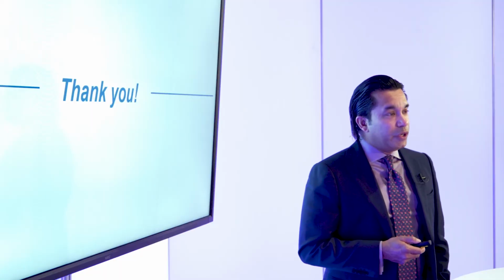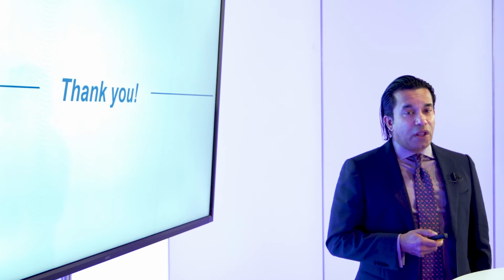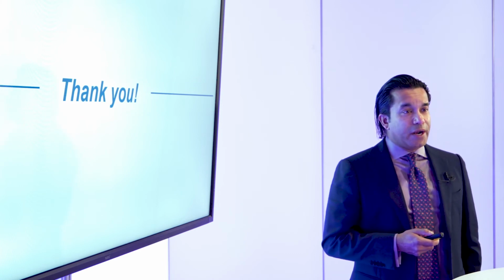So the question is, what tips and tricks are good for treating nodular calcium? I think it's a great question. I think realigning the transmitters, the emitters, to try to get right on the nodule. I don't think nodular calcium is the kind of case where you can be sloppy with technique, or just put the device in there and what you get is what you get, run out the 80 pulses and move on. I do think you have to be a little bit meticulous, as in the second case.